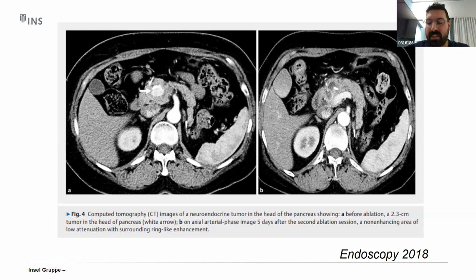Also es gibt natürlich bis jetzt keinen offiziellen Algorithmus in den Richtlinien, aber ich glaube, es ist sehr wichtig, dass man vor solchen Interventionen, wie bei der Chirurgie, vorher die Zysten punktiert, möglichst ein NGS-Panel, also eine Next-Generation-Sequencing-Analyse, macht und die Zyste so weit wie möglich entleert. Das wird auch helfen, wenn wir dann entscheiden, dass es ein Kandidat für RFA sein könnte, diese Intervention durchzuführen.